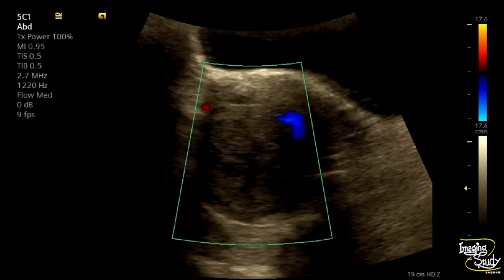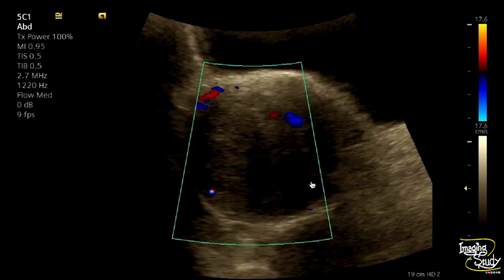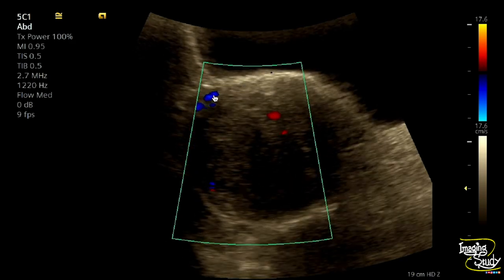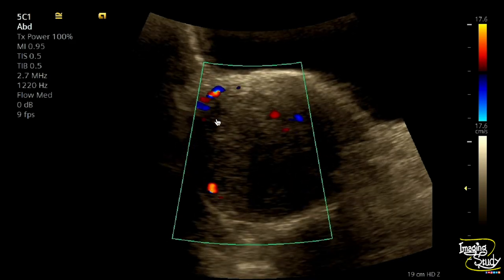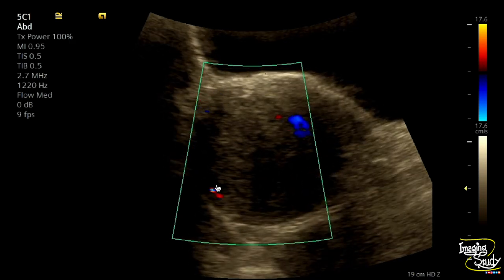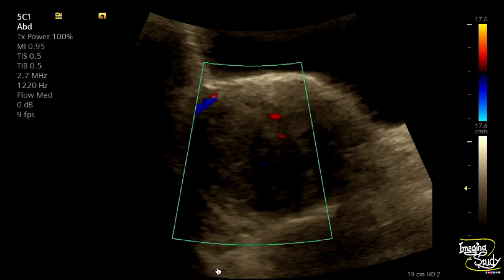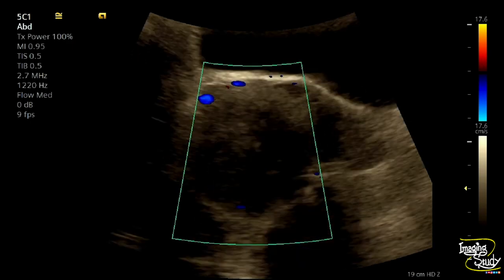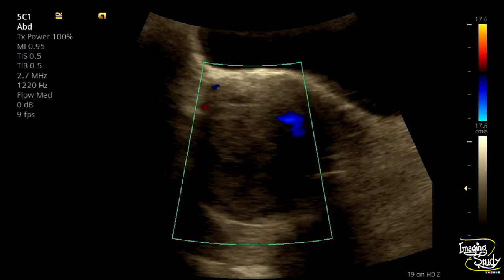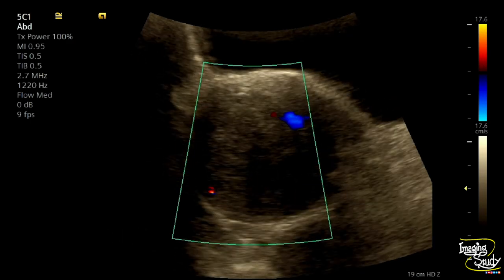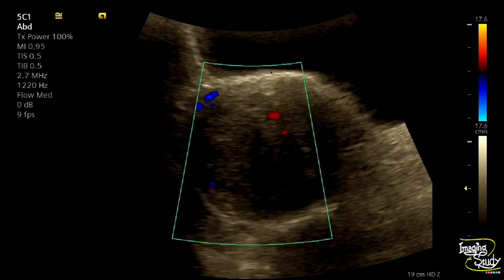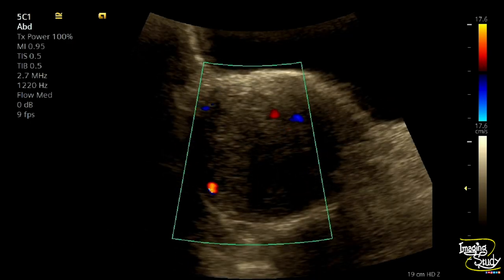Here we have applied color Doppler. With color Doppler, you can see the supplying vessels originating from the adjacent arcuate artery. The vascular pattern is predominantly peripheral, which is common in cases of fibroid uterus.